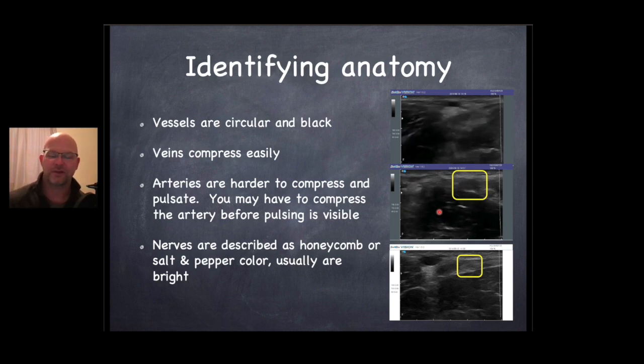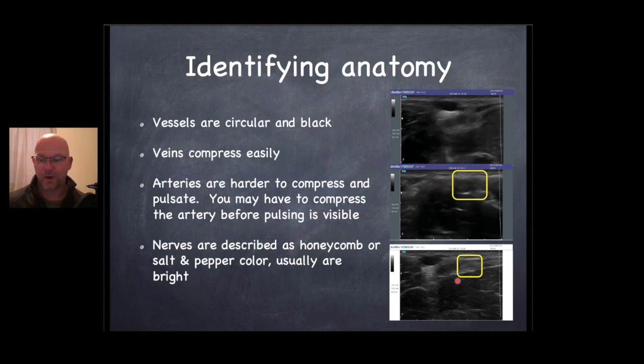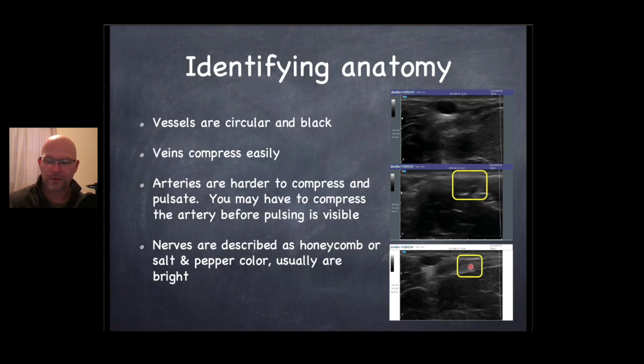So you do have to have a discerning eye with that. And the other thing, I can't honestly say I have hit one of these or knew exactly where that nerve was, but your nerves are non-compressible and they typically are a salt and pepper look. So this area right here is something that I would stay away from.